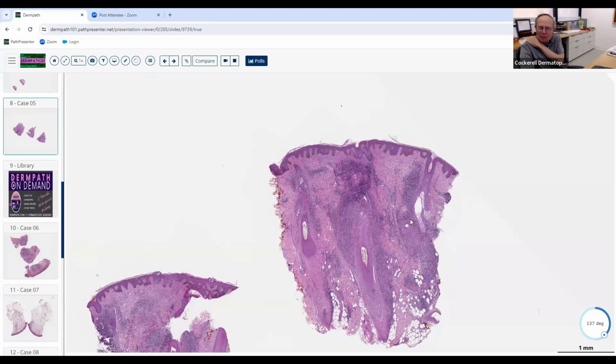Well, you do get sebaceous glands on the scalp, but usually the face has a lot more than this. So it's probably the scalp, but that's okay. You're right. It is a hair area. It's either going to be one of those two.